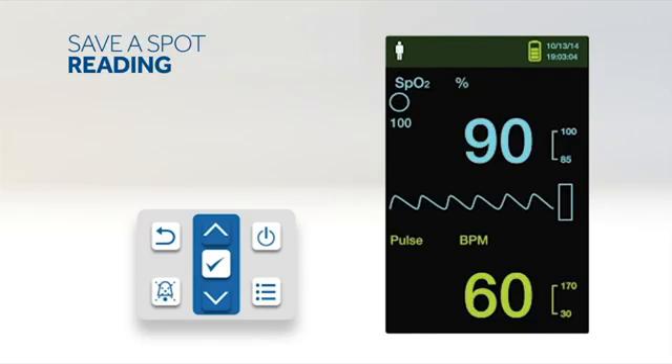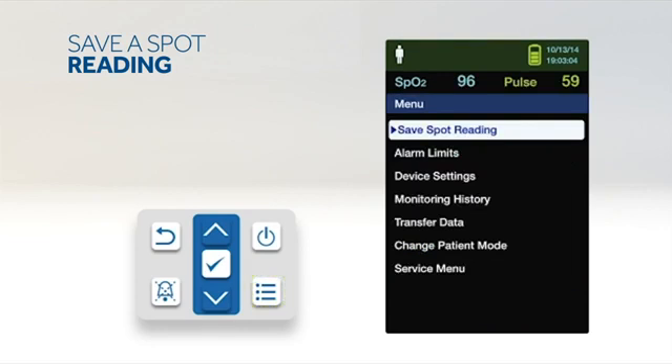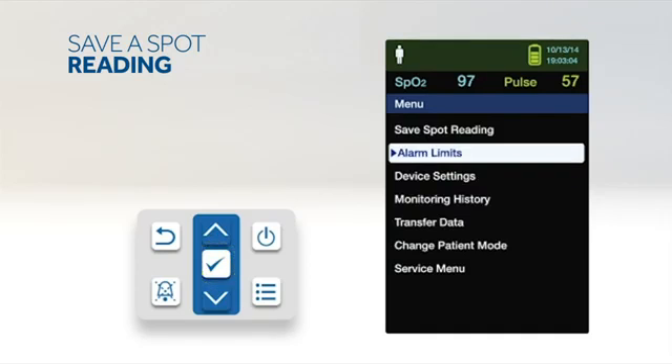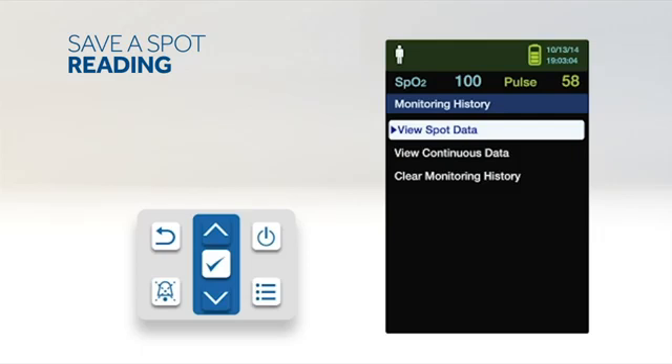The save spot reading function saves patient data at a specific point in time. To initiate the save spot reading feature, press the menu button, scroll to save spot reading, and press OK. Go to monitoring history to view the saved spot readings.